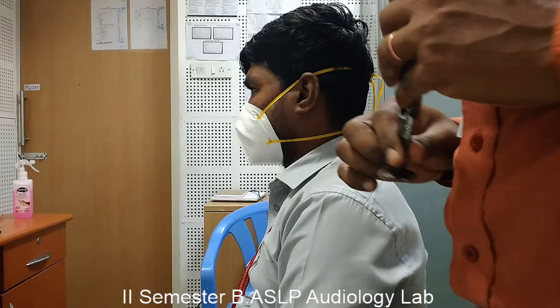If the subject says he is not hearing the sound in air conduction mode after indicating that he has stopped hearing in bone conduction, then that indicates a negative Rinne, which means the subject may have conductive hearing loss.